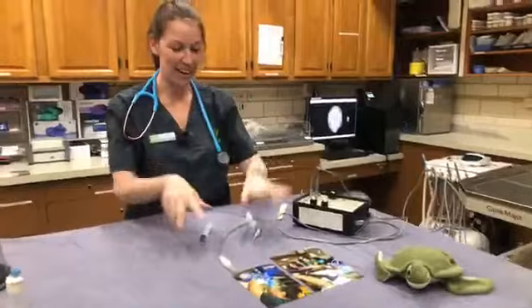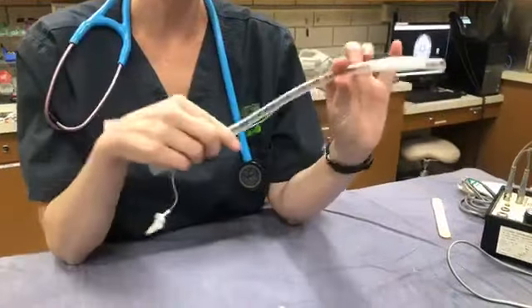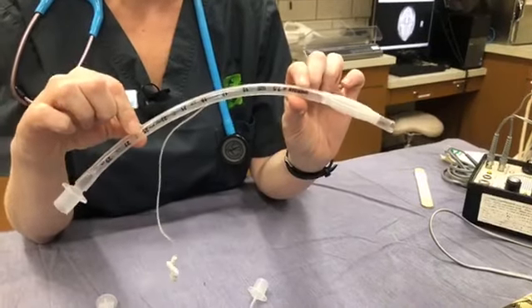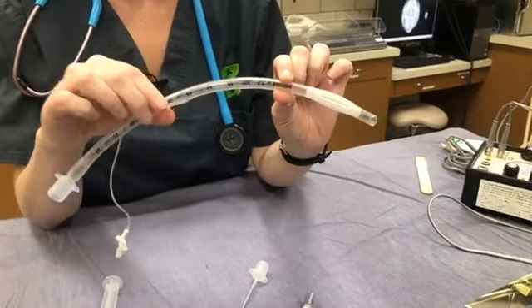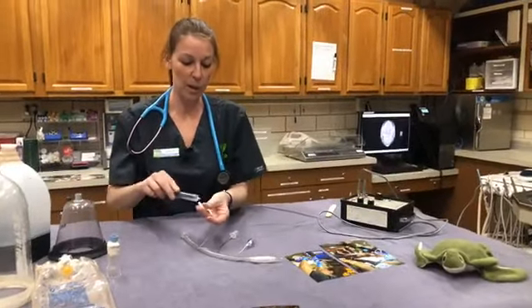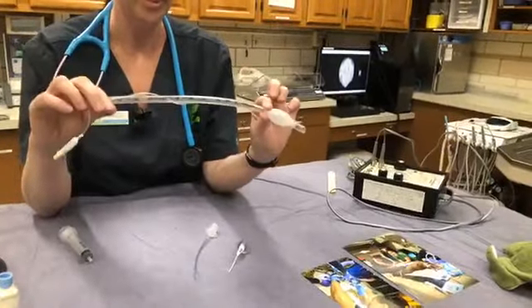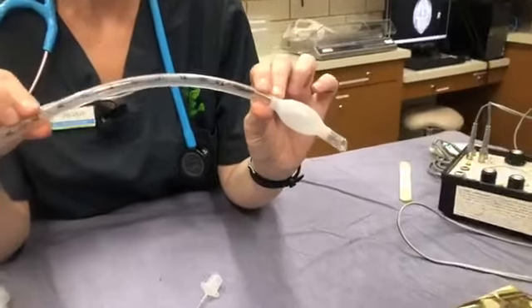And then, so we have also intubation. So you've probably seen these on like Grey's Anatomy and maybe Animal Planet. So when we anesthetize an animal, we intubate them. This is an endotracheal tube, so it goes down the windpipe. And this is how we keep the gas anesthesia flowing and their oxygen, and we can breathe for them if they need that. And so you just blow up the cuff with some air, and that gives you a nice seal. So there's no leakage. And this is a 7.5 size, so 7.5 millimeter.